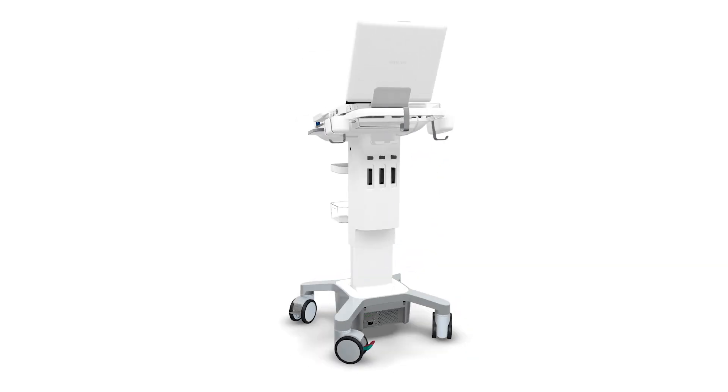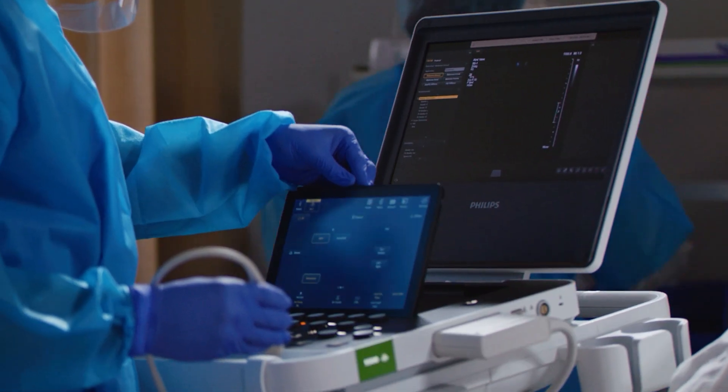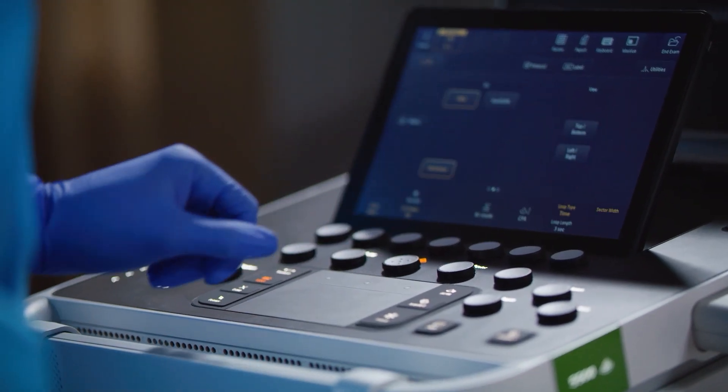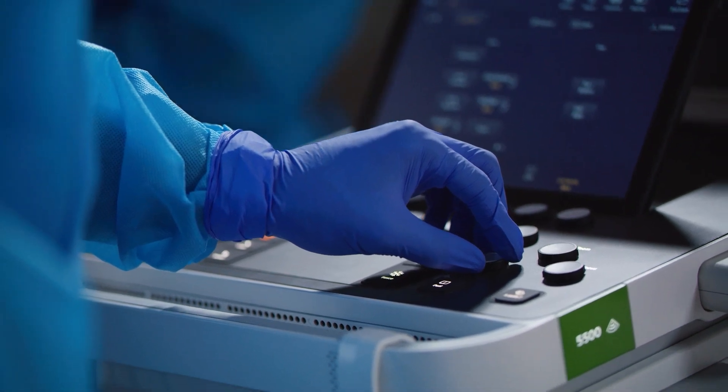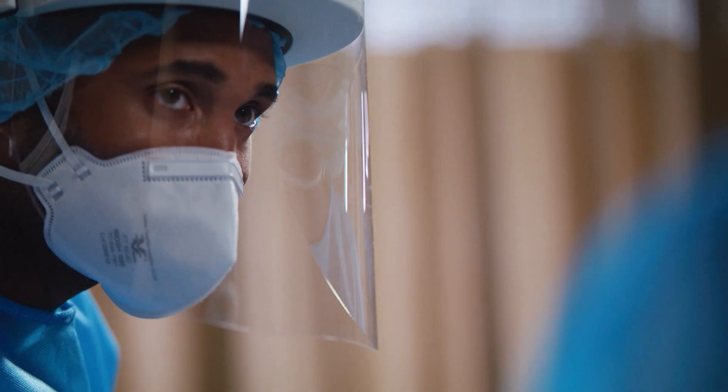Introducing the Philips Ultrasound Compact 5000 Series. With specific point-of-care ultrasound presets, configurations, and workflow, we have designed a system to fit you and not the other way around.